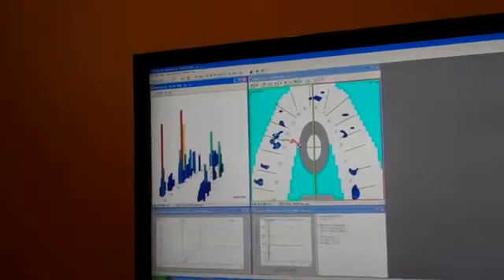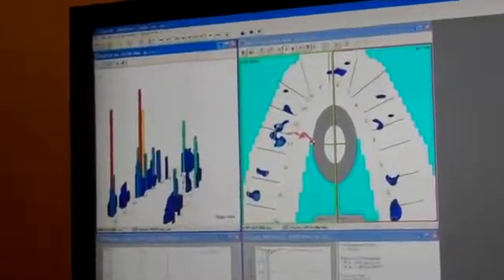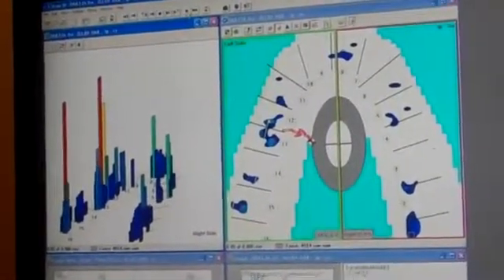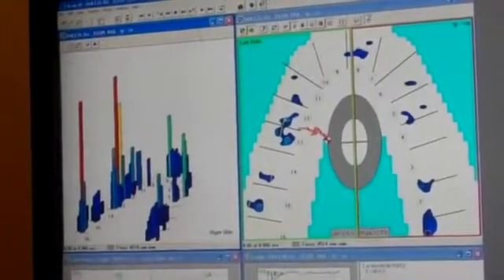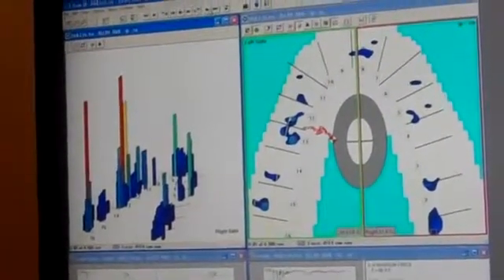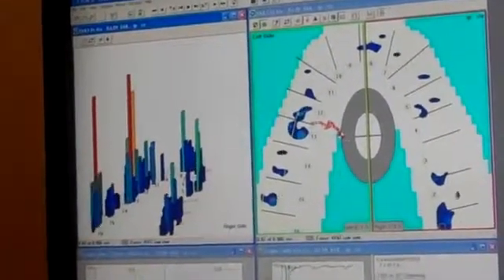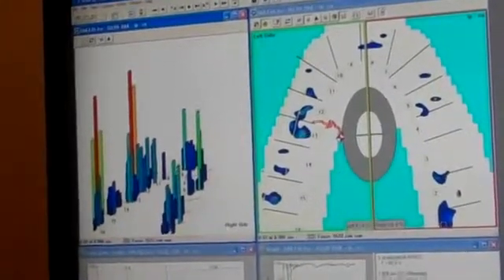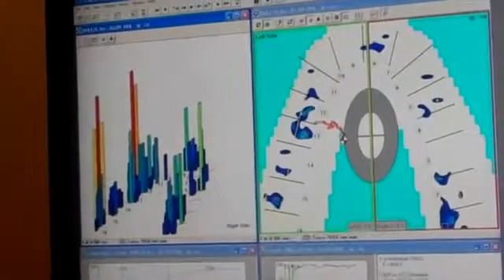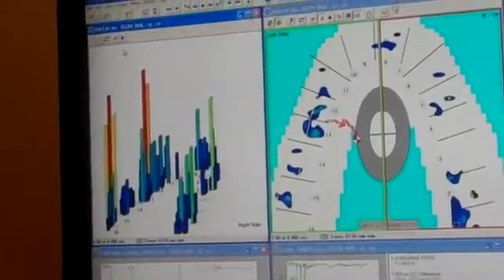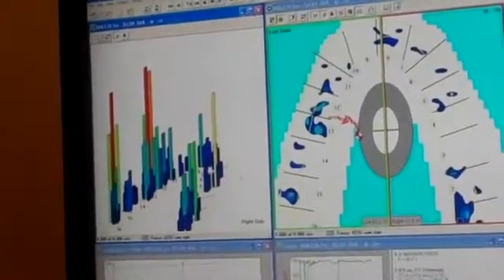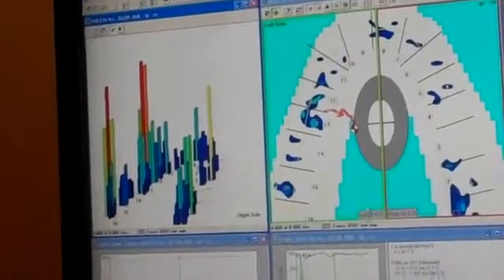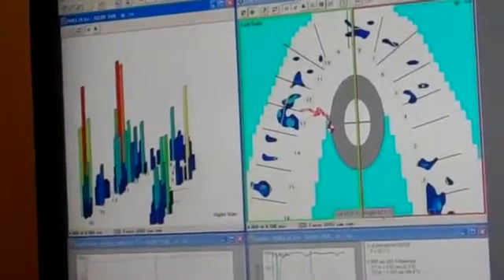We can also figure out why teeth are cracking and breaking. We can also look at what's called bilateral simultaneous, in other words, are the right and left side teeth meeting at the same time? For this particular patient, if I were to stop the moving and have her squeeze together, we notice that 60% of her force is on the left and only 37% is on the right. So we don't have to guess anymore.